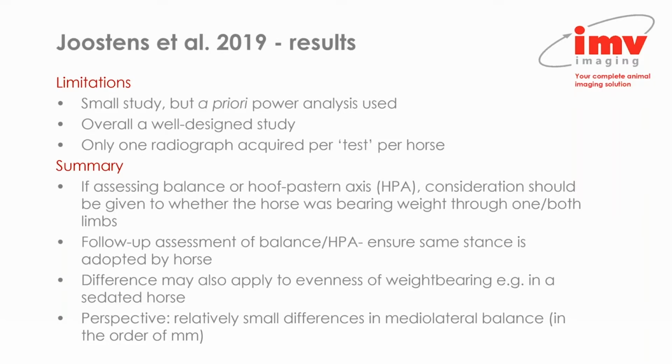So this was a relatively small study. However, they did use power analysis to ensure that they did have adequate numbers of horses in order to perform a statistical analysis of adequate power. Overall, it was a nice, well-designed study. Perhaps the one limitation that I thought of was that they did only acquire 1 radiograph per test horse.